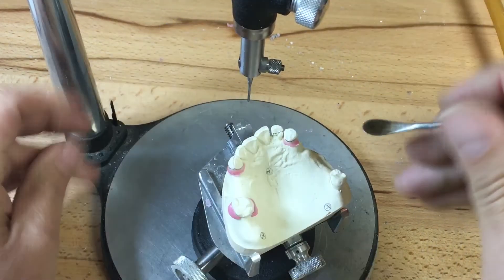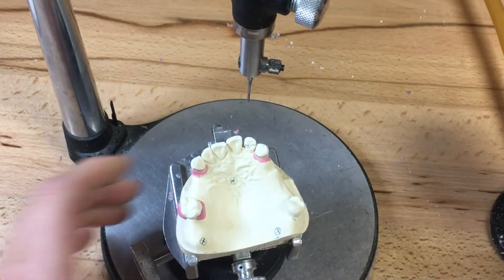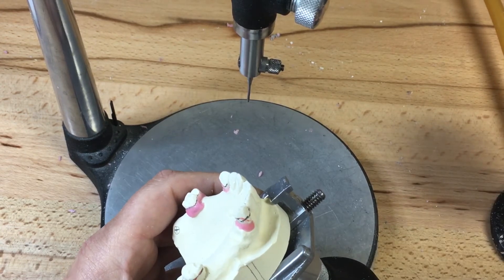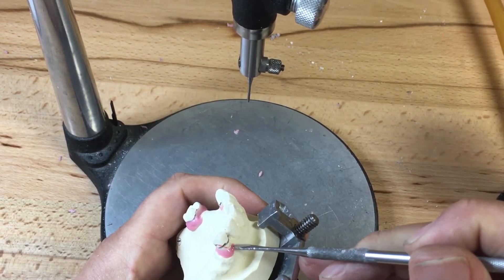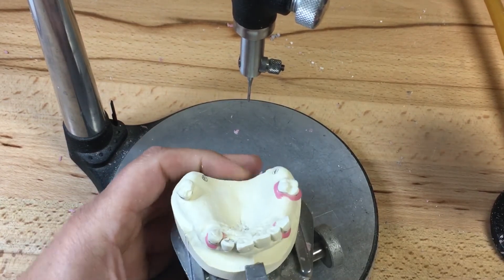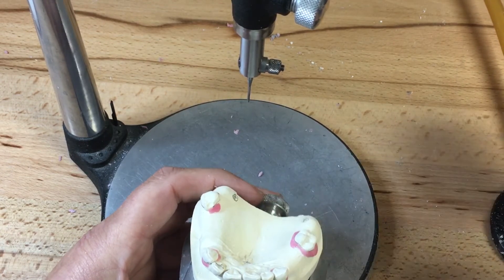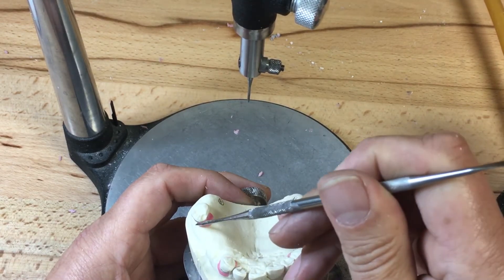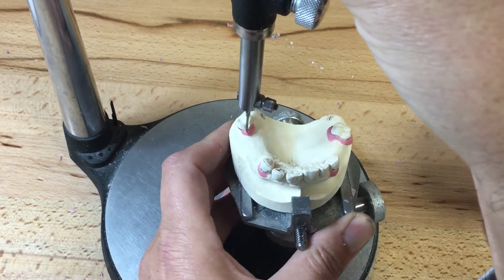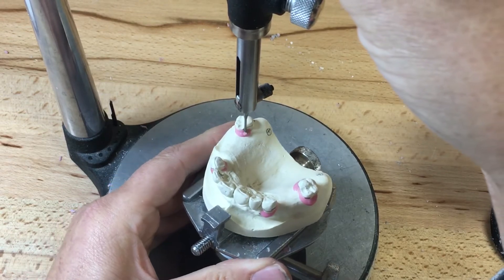I'm going to continue the same on 2-3, remove any excess wax, then move to the labial side and carefully ledge for the wrought wire clasp. This molar 1-7 seemed to have more of a guide plane undercut than the other side, due to the natural shape of the clinical crown. We can't alter the shape of the clinical crown post-final impression; any alterations clinically have to be done prior to the final impression.